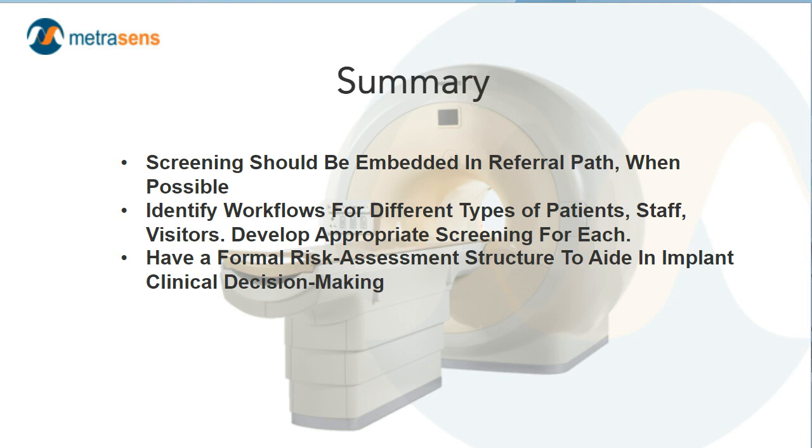Have a formal risk assessment structure to aid in your decision making. Make sure that implant risk assessments and risk mitigation steps are informed by a formal structure that reduces variability between technologist radiographers and radiologists and allows for more consistent patient care throughout.